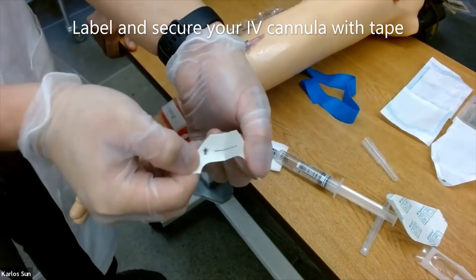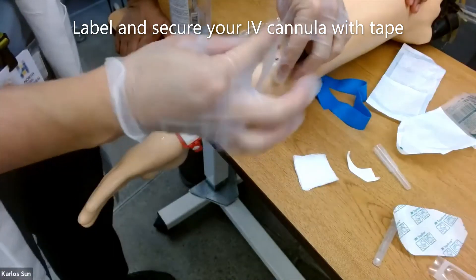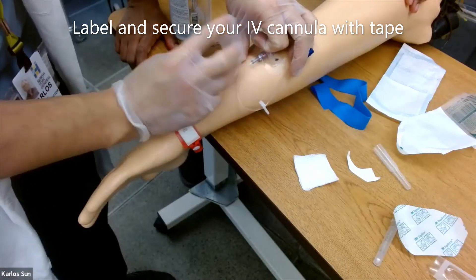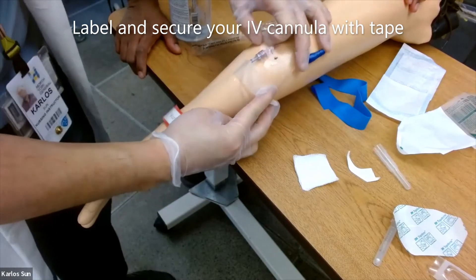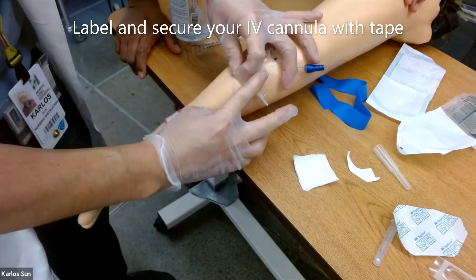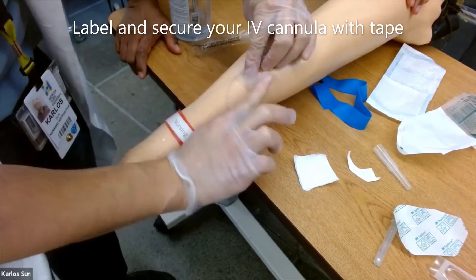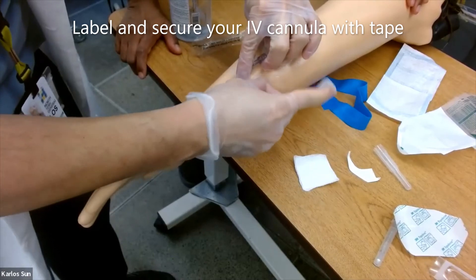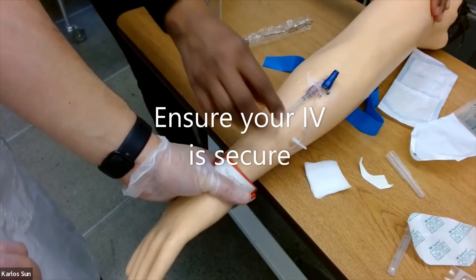Make sure to label and secure your IV. Ensure your IV is secure by giving it a gentle tuck.